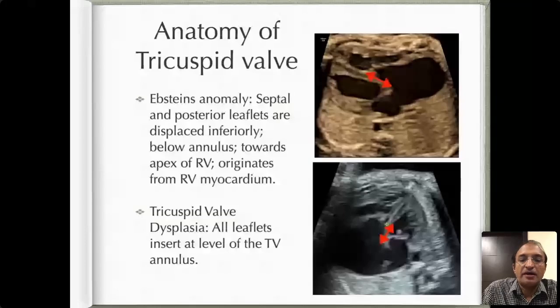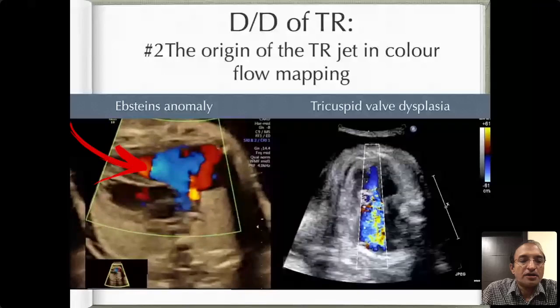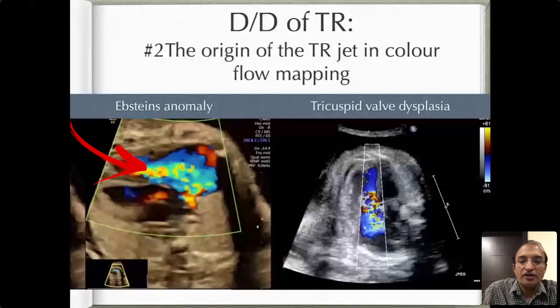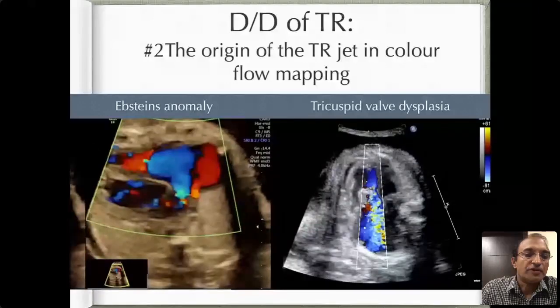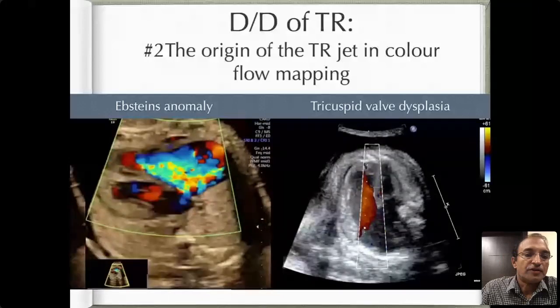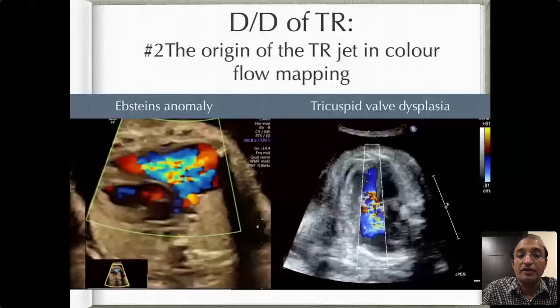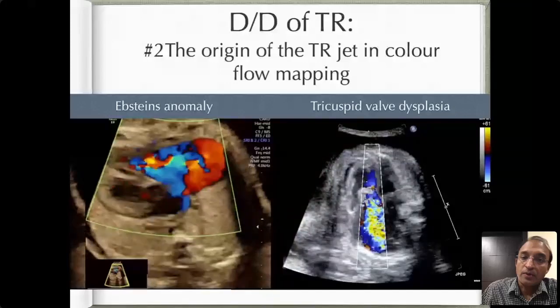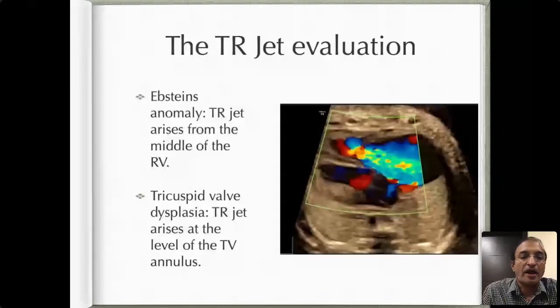The second is a simple radiological clue: the origin of the TR jet on color Doppler. In Ebstein's anomaly, even though we call it tricuspid regurgitation, the TR seems to originate in the middle to apical portion of the RV because the tricuspid valve is displaced downwards. In tricuspid valve dysplasia, the TR begins at the level of the normal tricuspid valve. You can see clearly in the still image that in Ebstein's the TR jet arises from somewhere in the middle of the RV cavity.